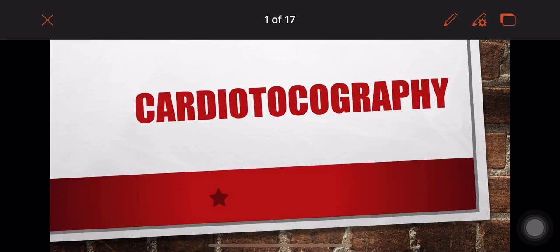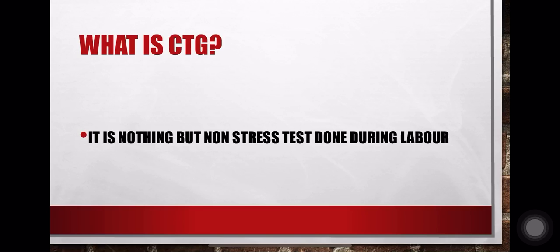Hello everyone. Today we are going to see about cardiotocography. What is cardiotocography? It is nothing but a non-stress test done during labor.